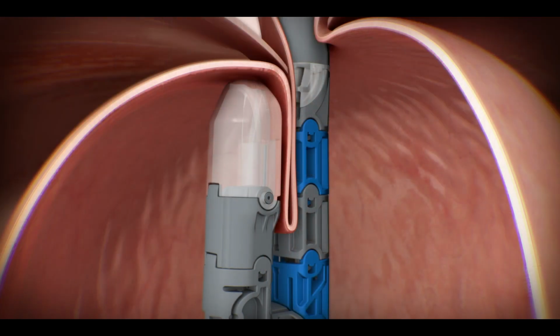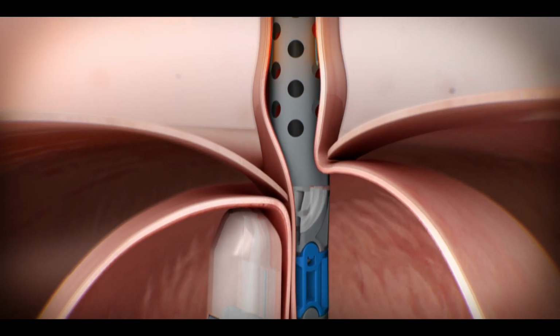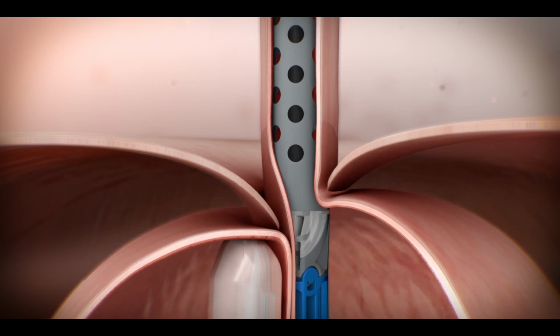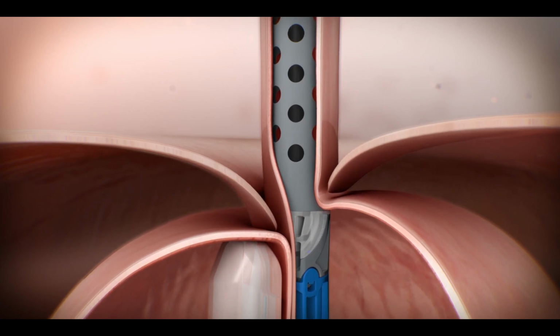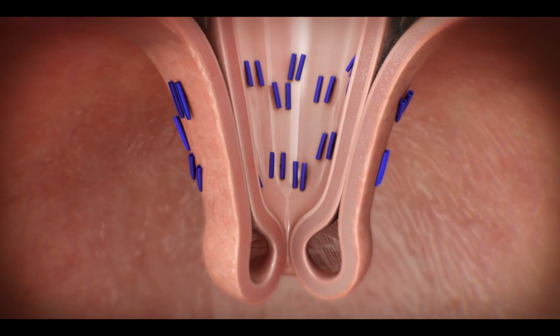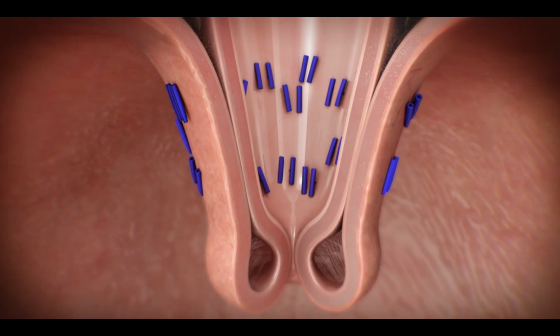The esophagus should be in the abdomen, or below the diaphragm, about an inch. In patients that have reflux, that distance is gone, or you have the opposite, which is a hiatal hernia. And therefore, what we call the lower esophageal sphincter is now loose or gone. So when we're doing the procedure, we're trying to recreate the anatomic position of how things are supposed to be.